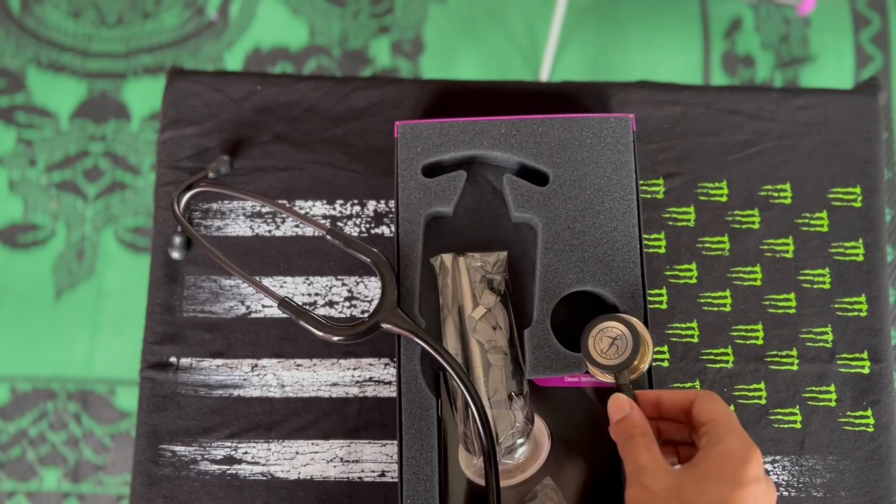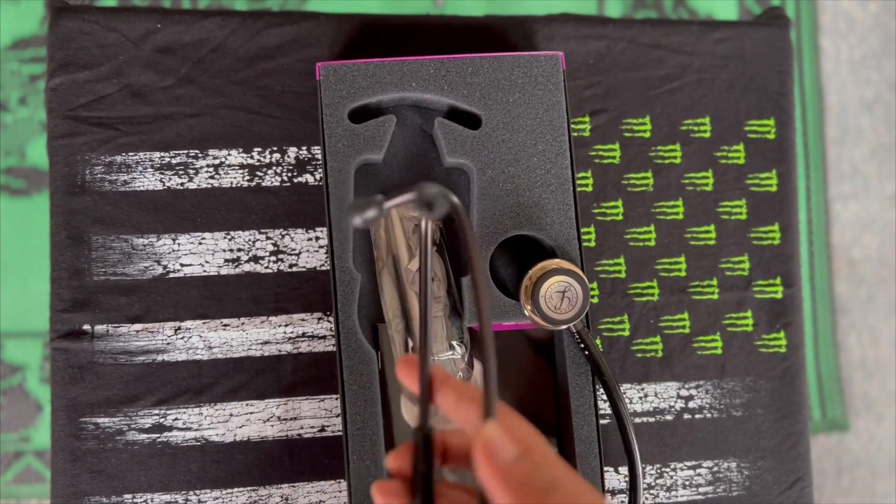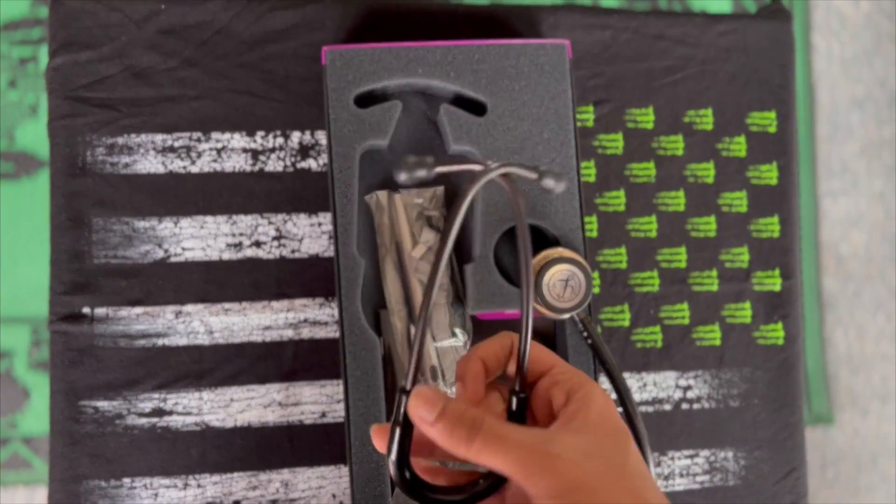We'll have a look at the main frame itself, which is actually a bit squishy — didn't expect that. And those are the earpieces.